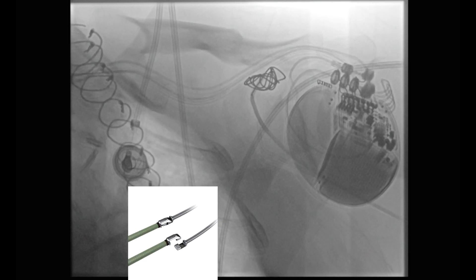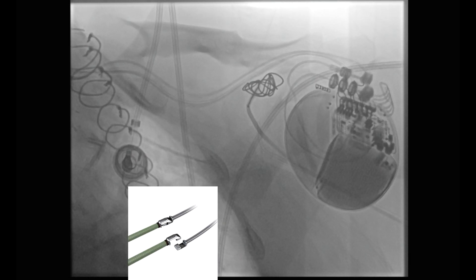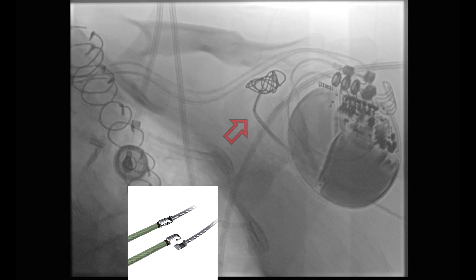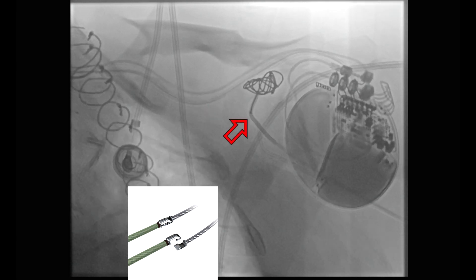Below, an image is shown of the coil detachment mechanism. The red arrow is marking the place of detachment.